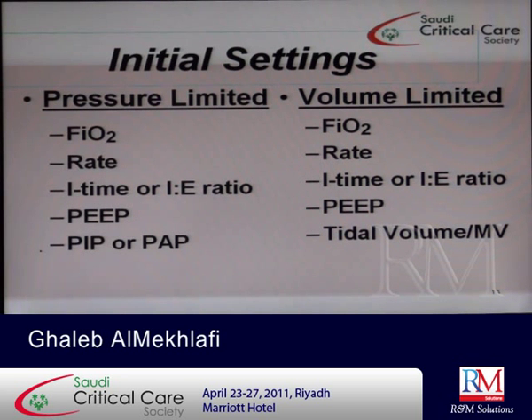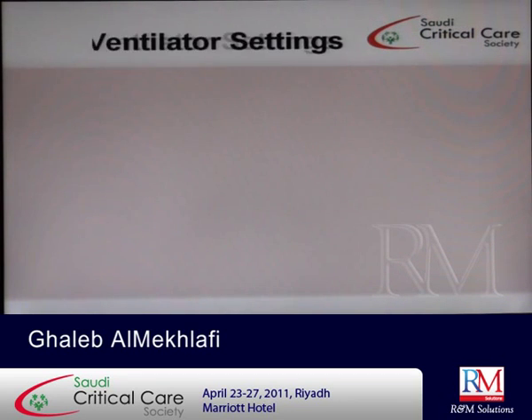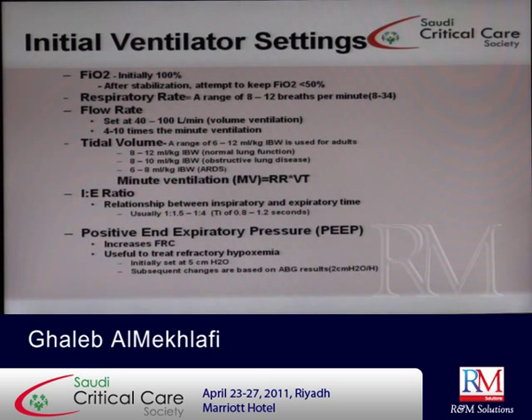In pressure modes, you are concerned about the peak inspiratory pressure or the peak airway pressure that should be set by you. And these are different terms used by different ventilator companies. So here you can either set the minute ventilation, like for example in Siemens, or the tidal volume directly, if you are using other methods. Okay. Now, these are the parameters that you are usually setting and their values.